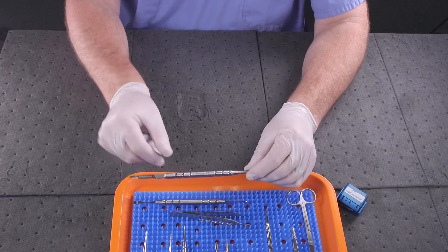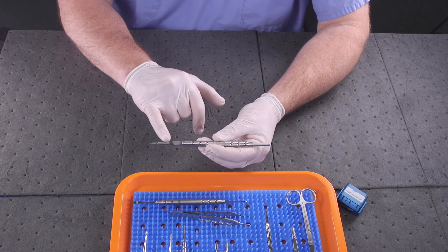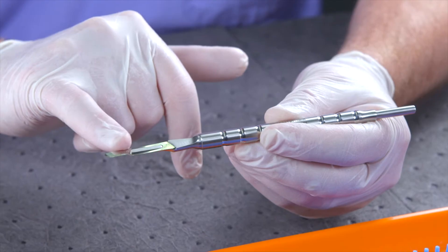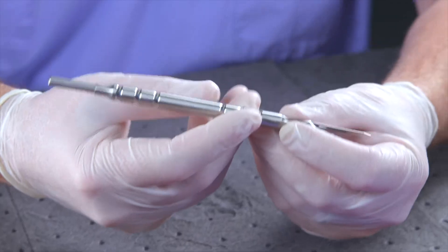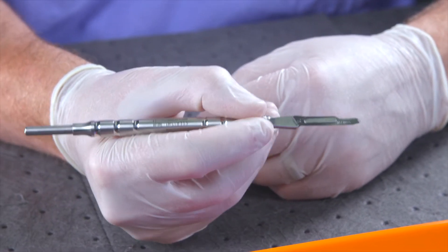This is the scalpel blade handle. It accepts standard scalpel blades such as the 15, the 15C, and the number 11 blade. This pen handle allows us to get a better grip to make procedures more precise.